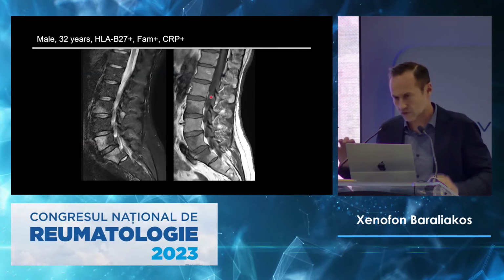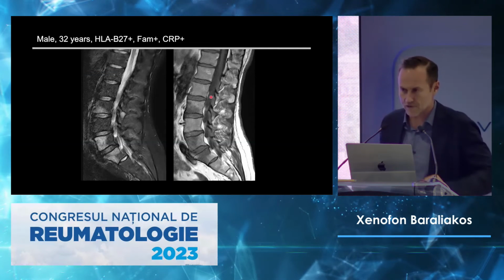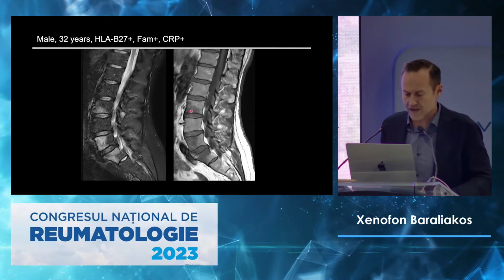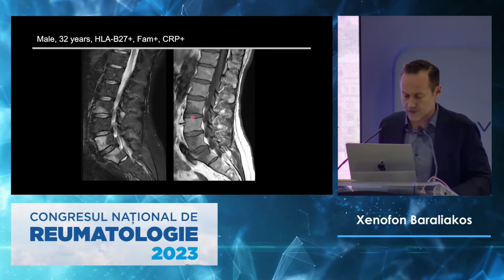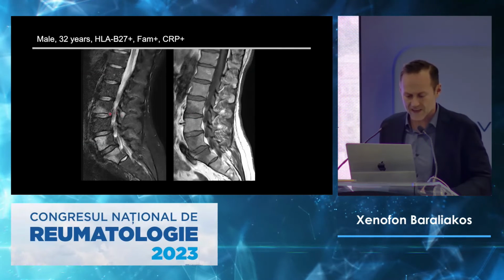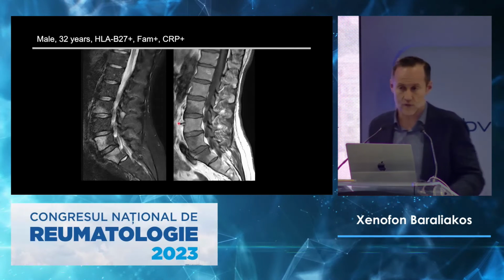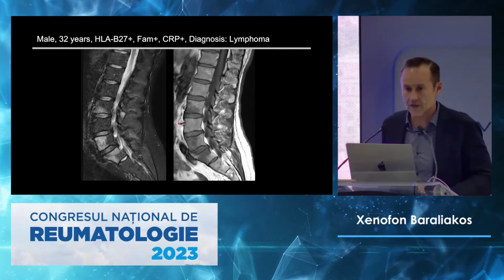Again, don't get too much confusion here, just so that you may have heard that. If you see these really very dark or darker, or you can also compare it with the disc, darker areas than the disc, and a lot of edema, be aware, although the good radiologists will also tell you this is malignant. Yeah? This is a typical lymphoma.